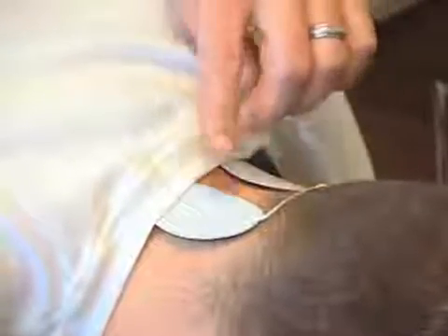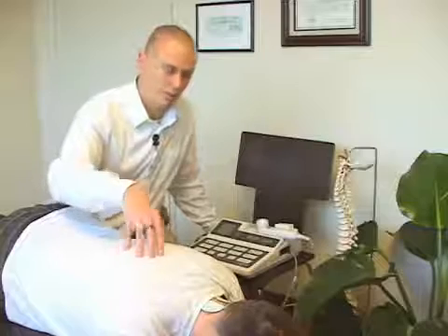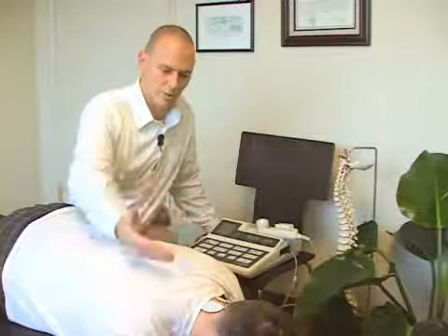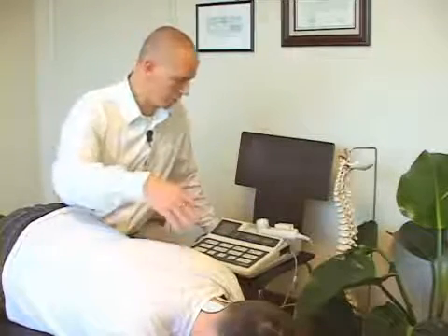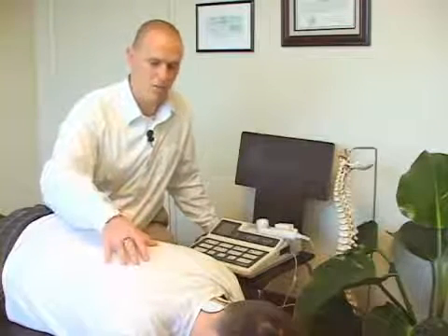For the areas of the cervical spine or the thoracic spine, we're going to get pads set up on the areas that we need to work on. The system goes on, we turn the current up, and the current is going to go through there for about 10 minutes, give or take. The job of the EMS is basically to promote more of a muscle relaxation.